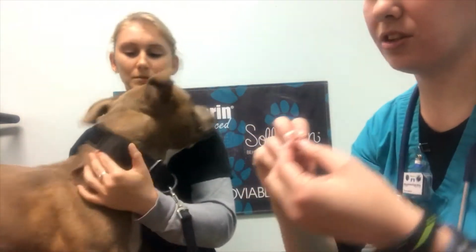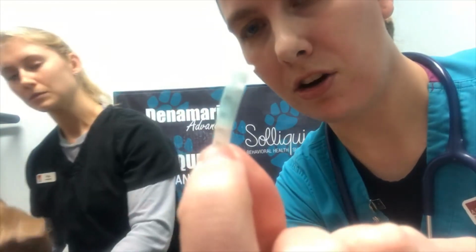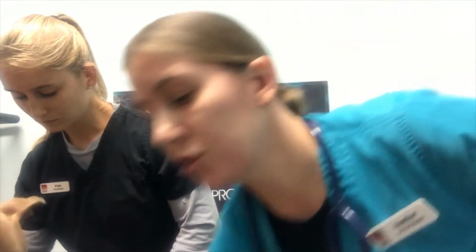And so his left eye came to about 22 there on our little strip. So these are good to know, indicate how their tear production is, and if there's any potential for dry eye. Like I said, greater than 15 is considered normal, so he's definitely in the normal range there.